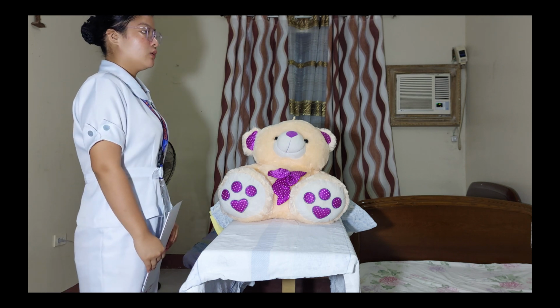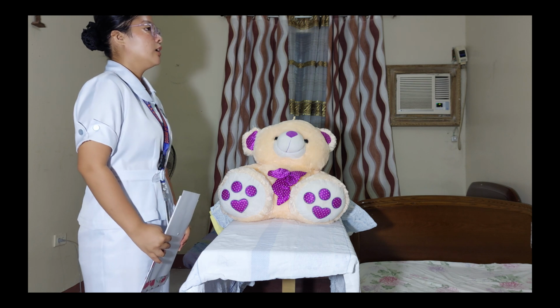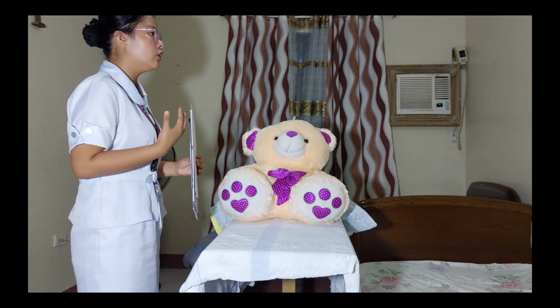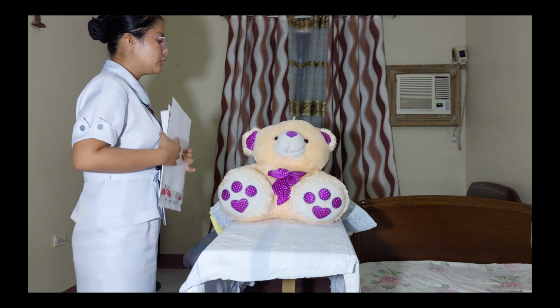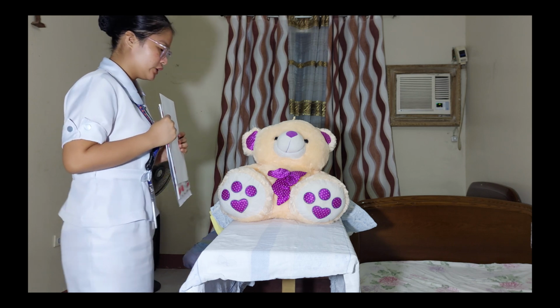Okay po. So, para po sa cooperation niyo, kailangan ko lang po na sundin niyo po yung mga sasabihin ko, which is base po sa procedure, and aalalayan ko po kayo throughout the procedure. Okay po ba yun? Thank you po.